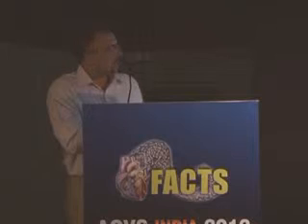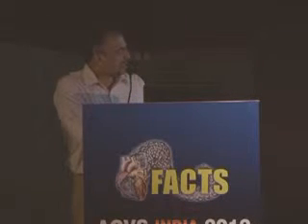If you look at the Tiger catheter, first of all, its support is much more in the arch and the distal part of the ascending aorta, and the terminal end of the catheter is actually in line with the recoil force. So once you inject contrast, the recoil force is what tends to kick this catheter back. Very frequently the catheter needs to be repositioned during coronary angiography when you are using a Tiger catheter. So this is very important to understand, why this recoil occurs and how to deal with it.